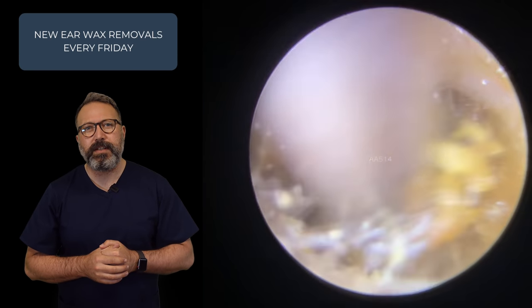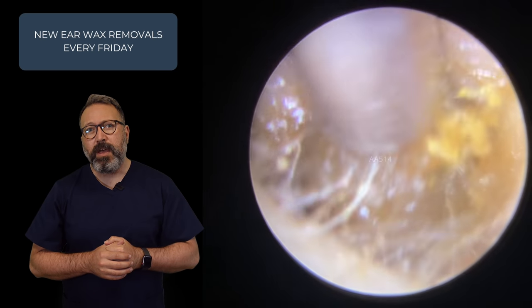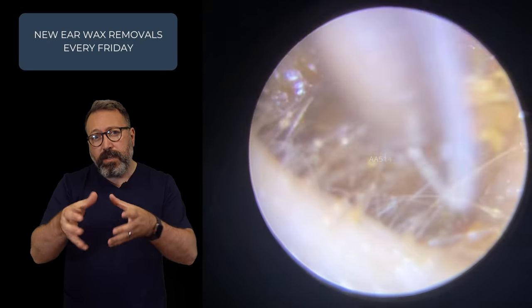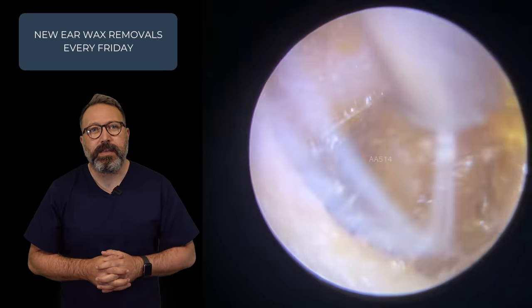So trying to detach from all sides here, very, very slowly working this down. You can see I'm just trying to wiggle back and forth — unsticking from one side, drawing forwards, unsticking from the other, drawing forwards again. It's a bit like trying to get something out of a very tight gap. You've got to kind of wiggle it to get it out, and that's what we're doing with this wax here.